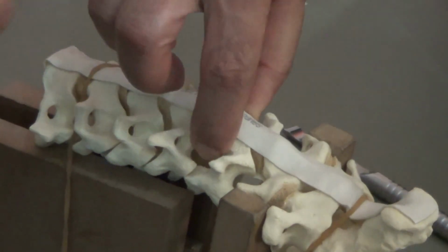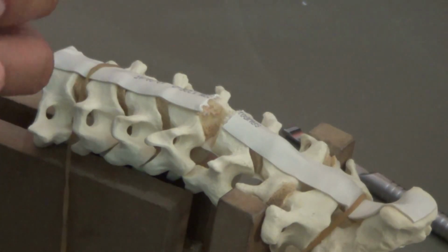Then when taking the iliac crest graft, you will have to be very careful to do things when you take the iliac crest.